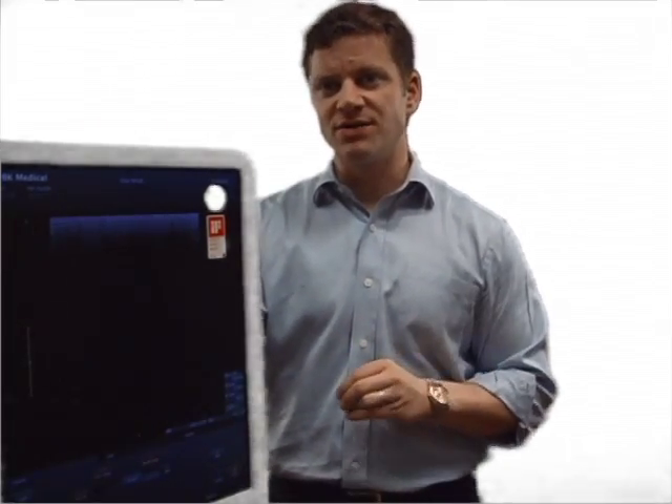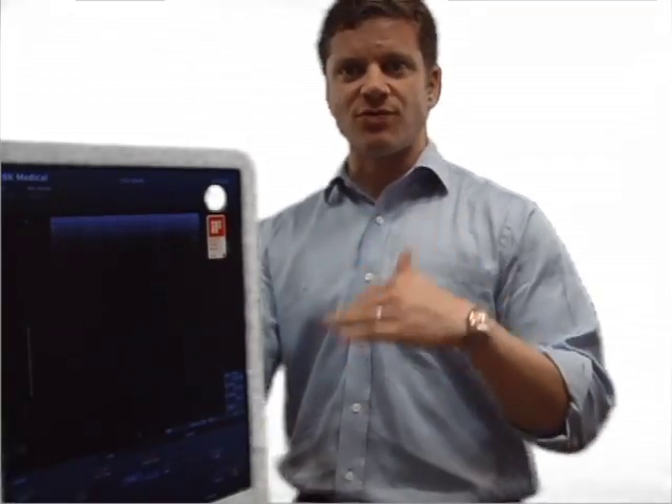Hi, I'm Paul again. We're going to be going through glenohumeral joint injection and I'm going to show you two different techniques: one is medial and the other one is lateral. The settings I have on the ultrasound system — I put in about five centimeters, dropped it down to about 12 megahertz, and my focal zone is about three-quarters of the way down the screen. Those are the three adjustments I made prior to the video.